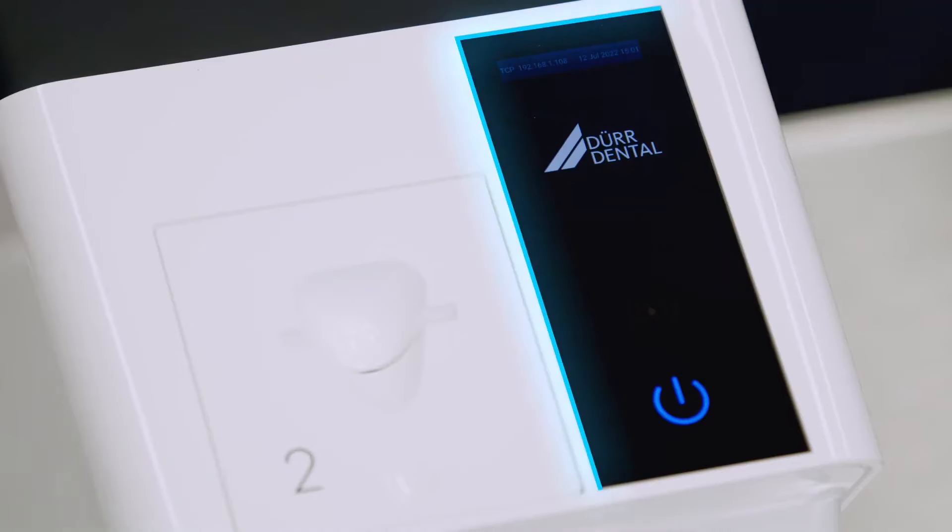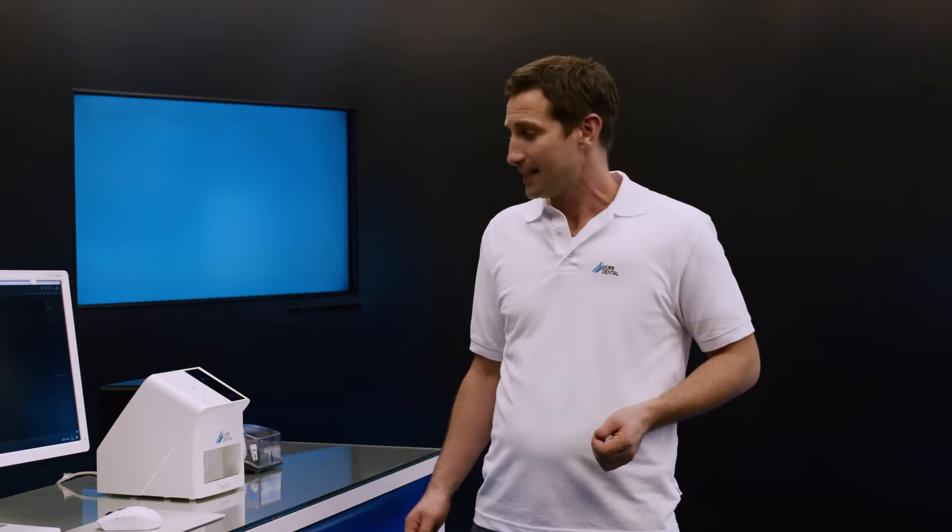Its glass display provides the user with intuitive and effective operation. And through the Easy Feed concept, image plates can be read in very easily and quickly, one after another. The VistaScan MiniEasy 2.0 is produced at our facility in Bietigheim-Bissingen. Top quality, made in Germany.